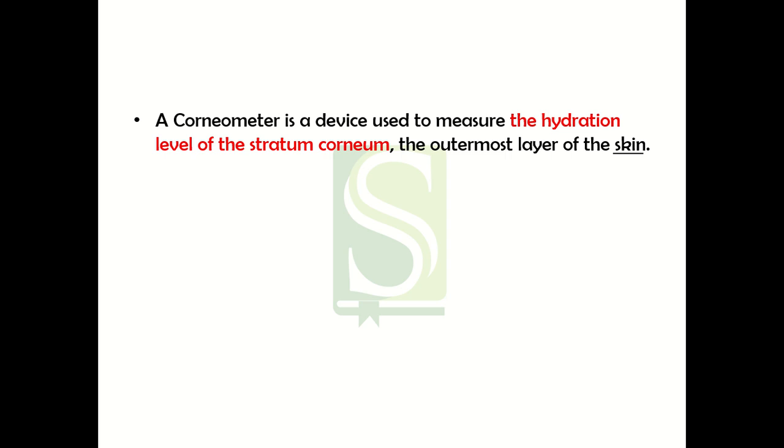Welcome students. Today we are going to learn about the corneometer. Now what is a corneometer? The name is telling you that you can measure the properties of your stratum corneum. So what is the property of your stratum corneum?